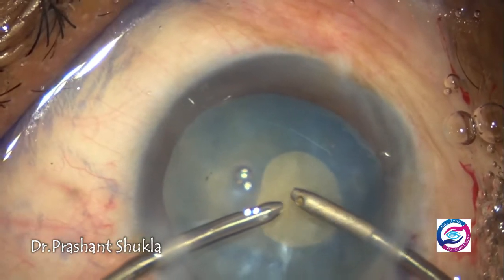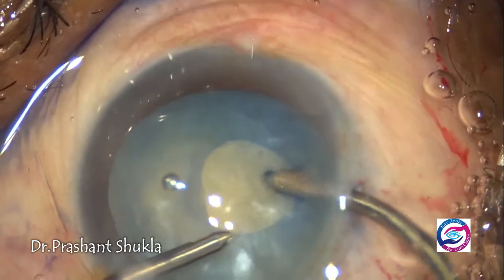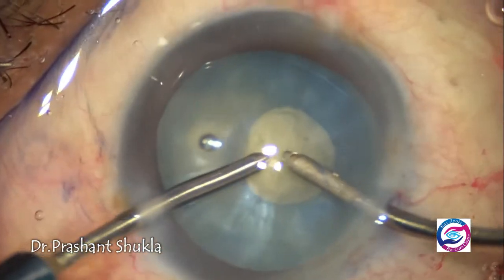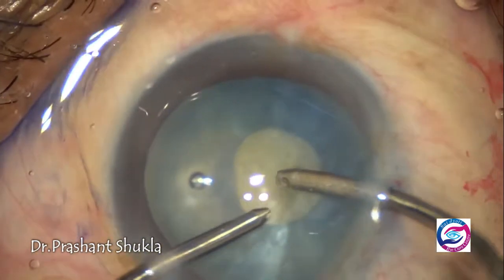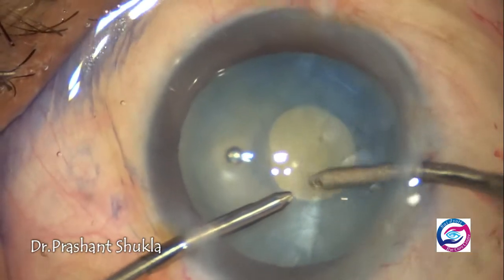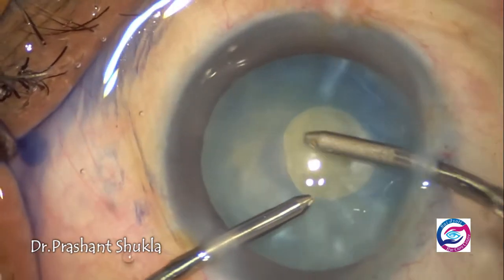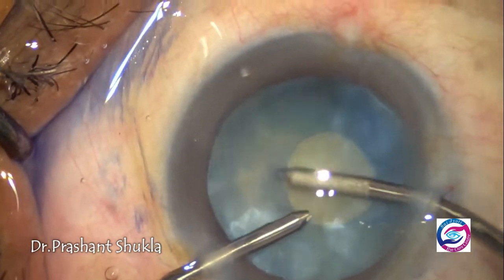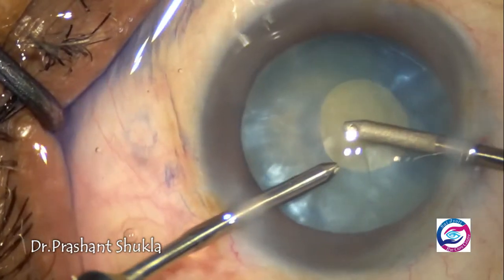It is a slow surgical demonstration, and the clip is almost unedited for better understanding of the technique. Here I am using the bimanual irrigation aspiration to tap the nucleus and to remove any entrapped fluid and loose cortex to decrease the intralenticular pressure. It is a good idea to get out all the loosened cortex and decrease the intralenticular pressure as much as possible.